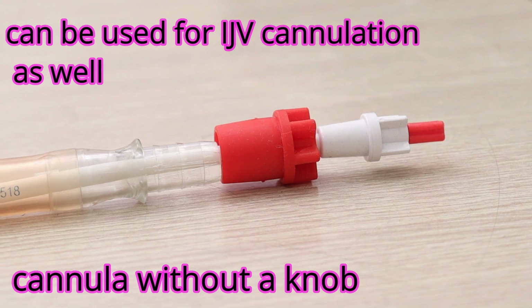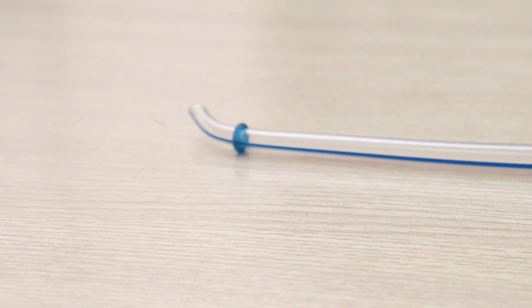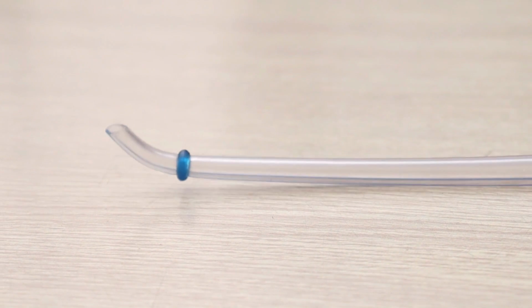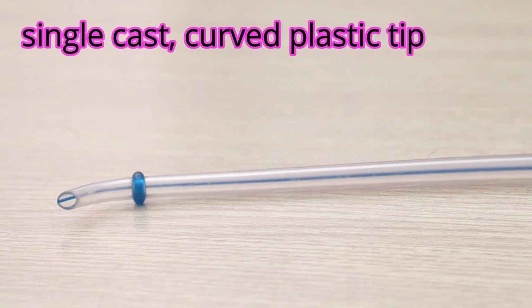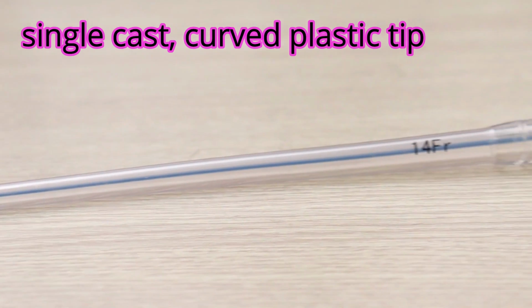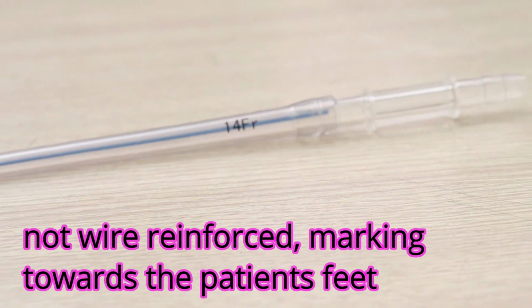Now coming to another form of cannula, as you can see here, it's a single cast, no connector, curved plastic arterial cannula. But here the marking is away from the anesthetist, that is towards the foot end of the patient. As said before, you should always watch for the marker.